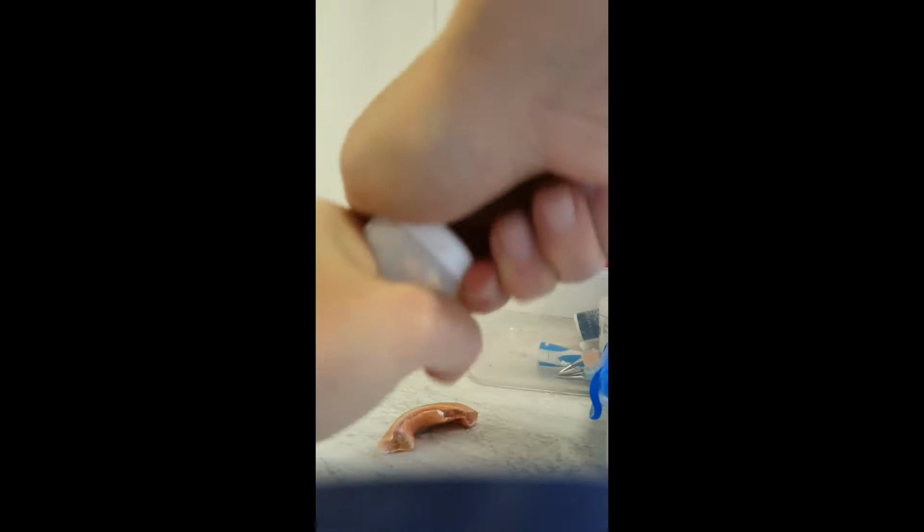The earbud I can throw away just now because I'm not going to use it. And also always immediately close the glue in case you knock it over. So if we have a quick look on my watch, don't know if you can see, it's now about 7:10. I'm now going to stop this and I'm going to have a coffee or do my face makeup because that needs to set before we can attach and I can show you further.